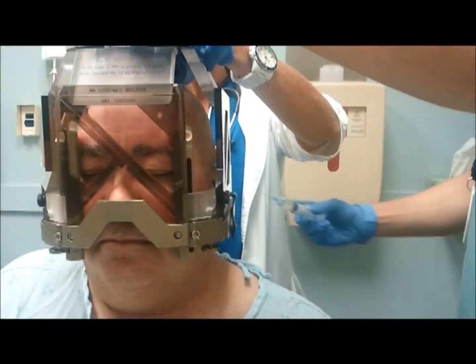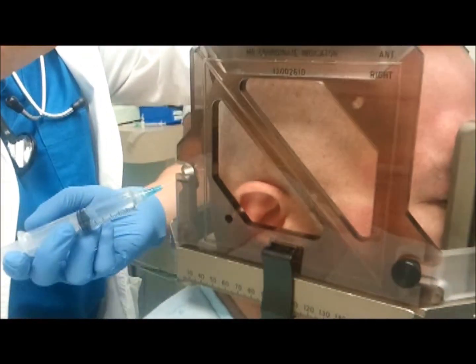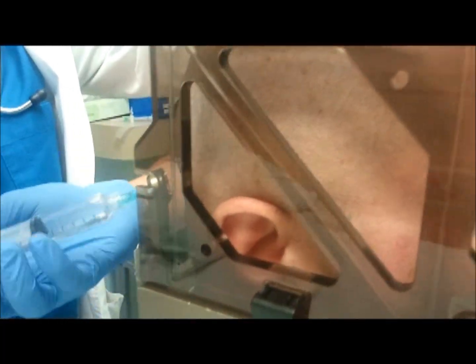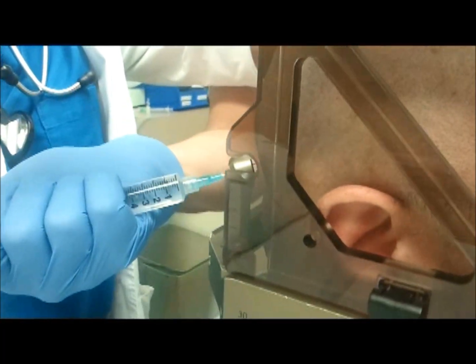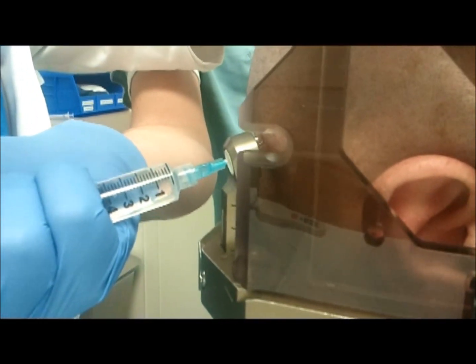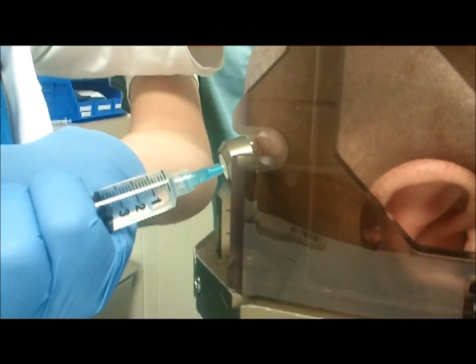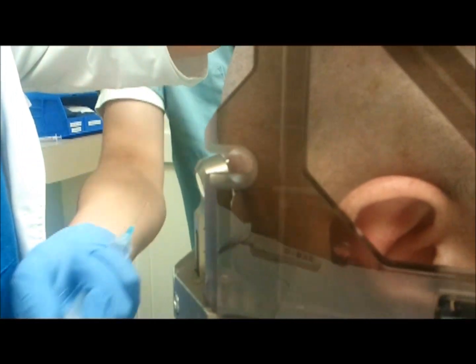We'll move to the last one, which will be here on the right side in the back. One, two, three, and the last poke. One, two, three, and the last poke. One, two, three and a half. All right.